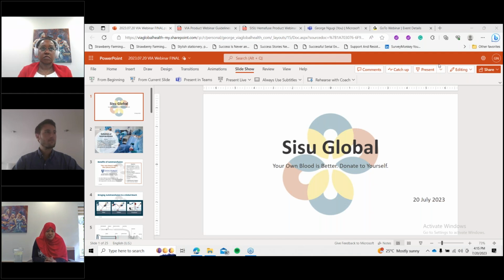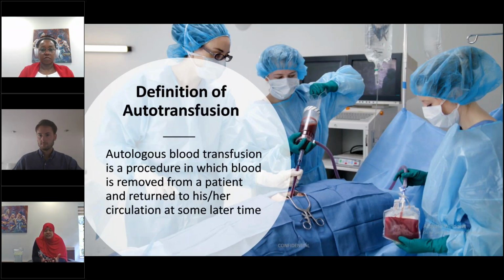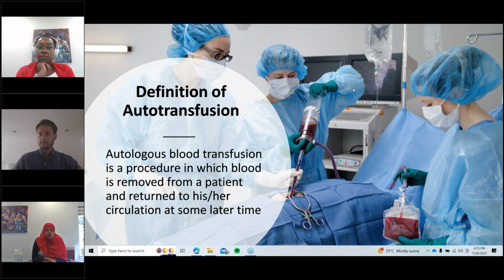The surgical procedures where this particular device can be used include general surgery, for example a ruptured spleen, a ruptured liver, or even a road traffic accident where we have pooling of blood that is collected somewhere. It can still be collected by this particular device. We have seen a lot of use in obstetric and gynecologic procedures, especially a ruptured ectopic pregnancy, where there's a pool of blood in the abdomen, and this device can be used to collect the blood and give it back to the patient. We have also seen it used in some orthopedic surgery, like open hip reduction or total hip replacement, where the bleeding can be collected and given back to the client.